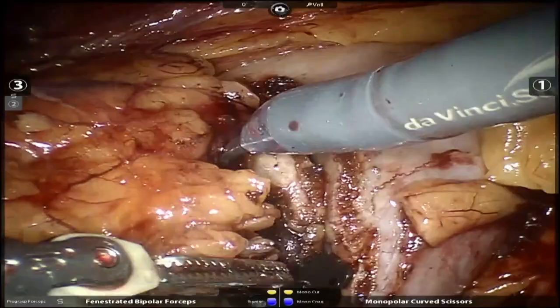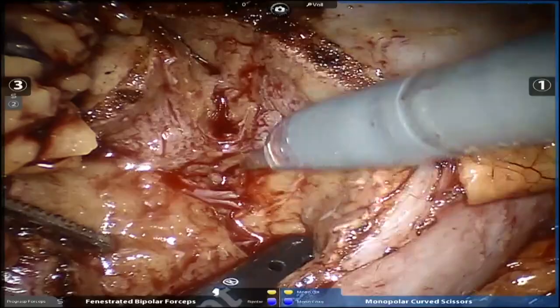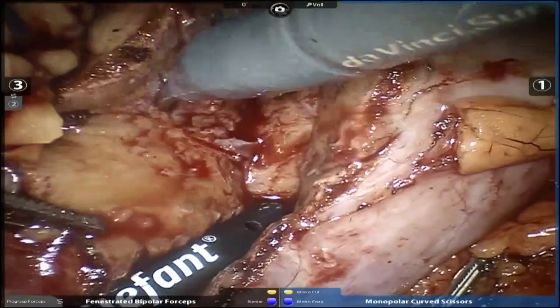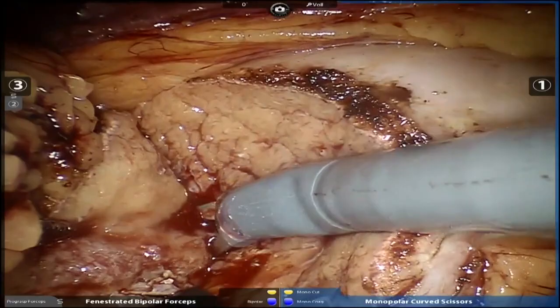Come on, Brando. Yep. All right. You're going to clip those vessels? No. I'm going to do something to them. Looks good so far. I think it bears mentioning, maybe people don't do this a lot, that you haven't dug yourself into the hole. You're still kind of working at the edge, little by little.